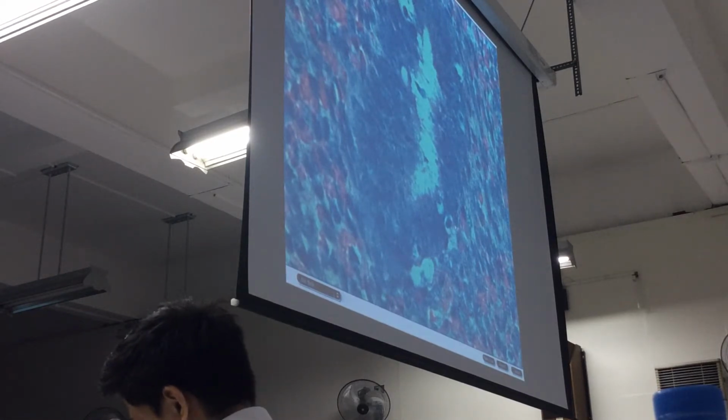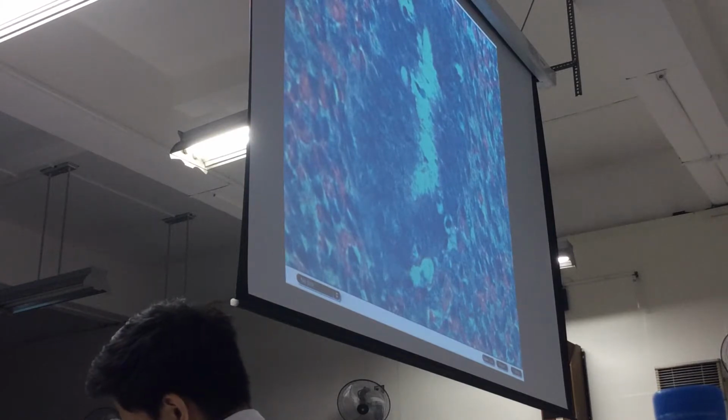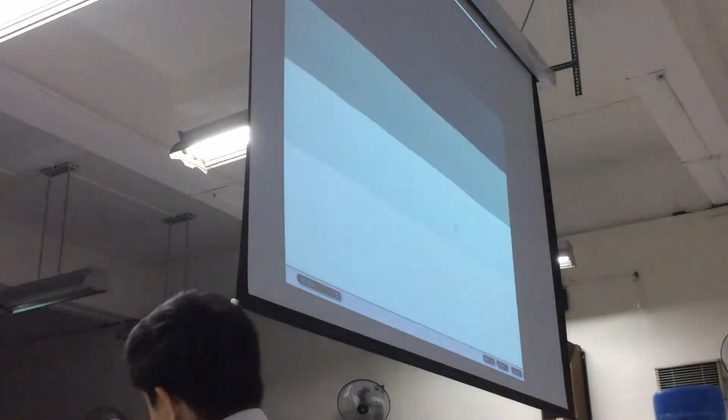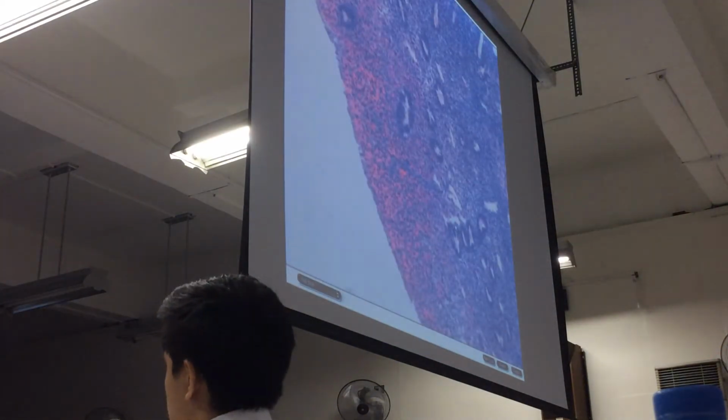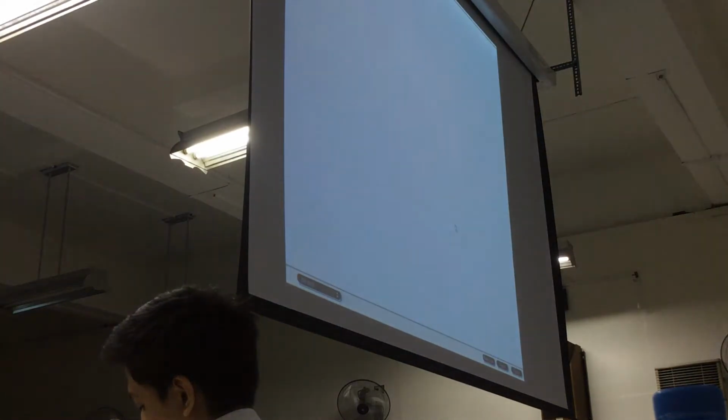Likewise, the endometrial stroma, which is known as your embryonal type of connective tissue, seen here, does not show any decidual change. So it seems as if they don't have cytoplasms. Okay? This is a proliferative endometrium. Let's go to slide number 37 and slide number 87. We'll just show you one slide.